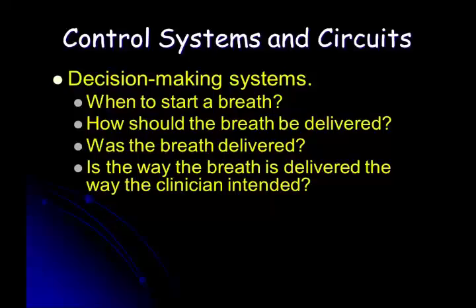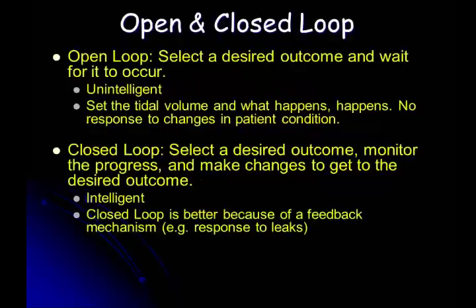It also needs to know whether or not the breath was delivered. Was I open long enough? And was it the way that we intended it? So there's two different ways to approach this. I can have an open loop system or a closed loop system. With an open loop, it's pretty much idiot-proof.